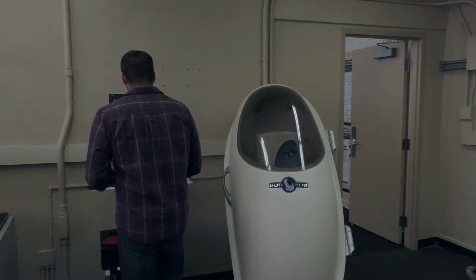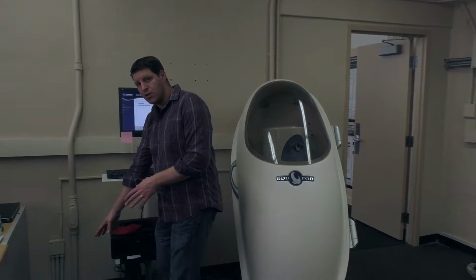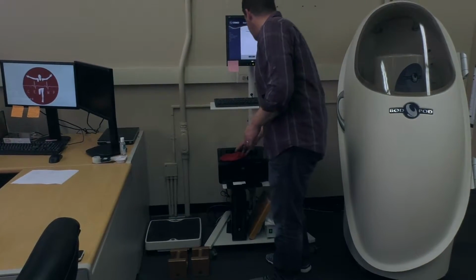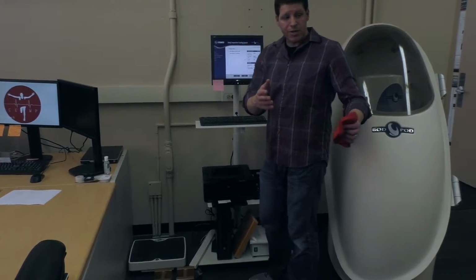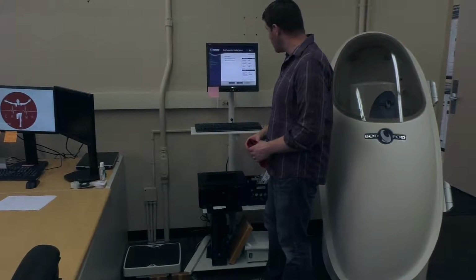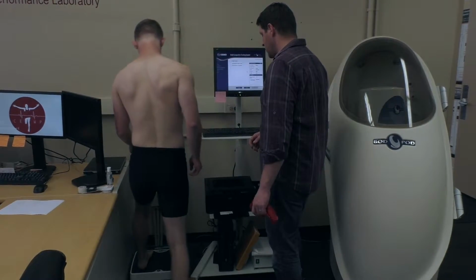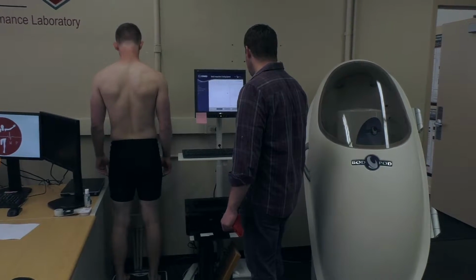Once we do that, we can actually get mass. This is very, very important. We have a highly accurate scale down here. We're going to click to tare the scale. And then we can ask the subject to come on over and step on the scale. Once we do that, we just need to make it clear that they need to hold as still as possible. We're going to measure it.